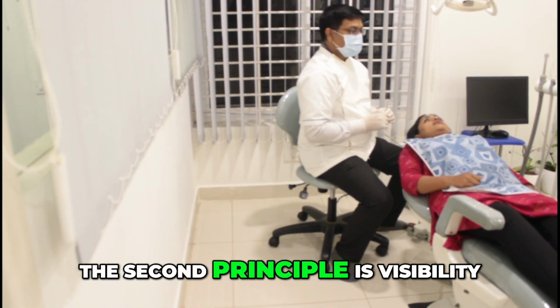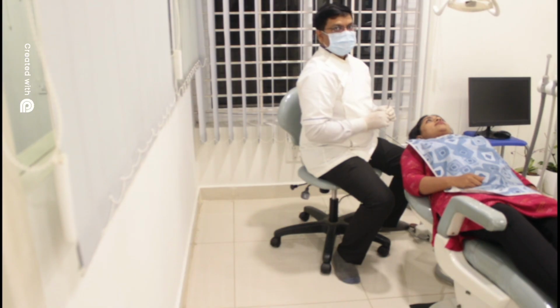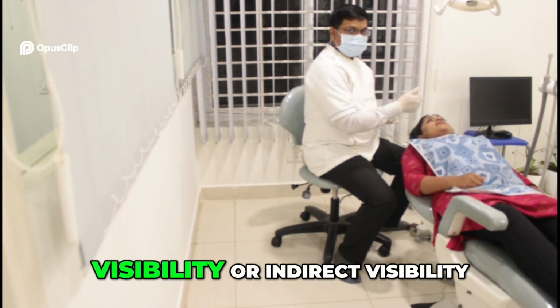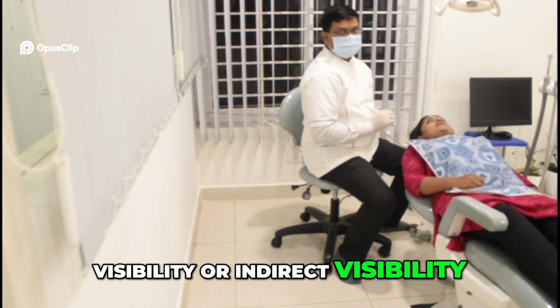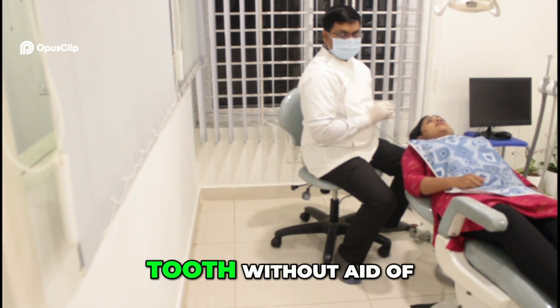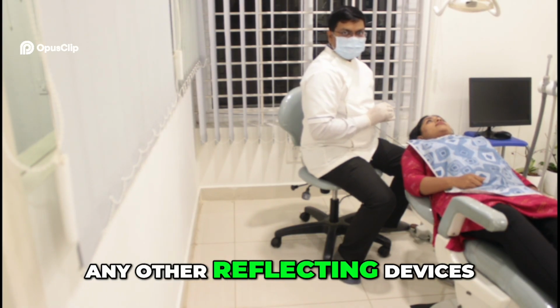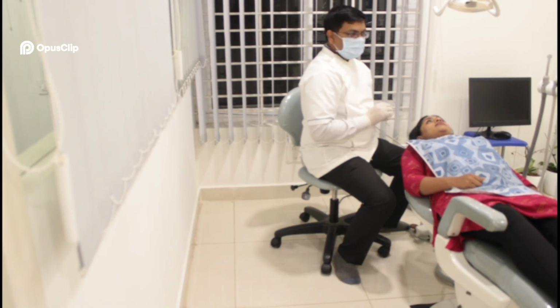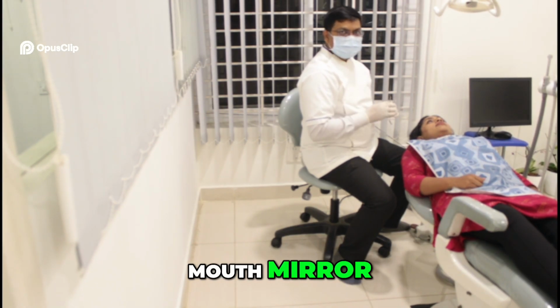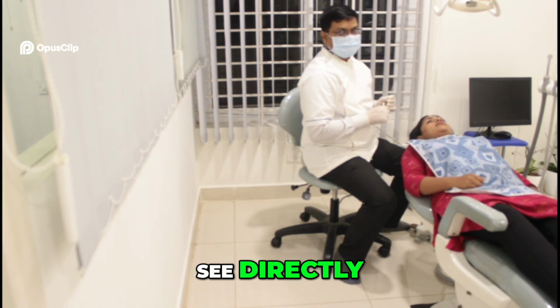The second principle is visibility, illumination and retraction. When we say visibility, it is either direct visibility or indirect visibility. Direct visibility is when I directly see the tooth without the aid of any mouth mirror or any other reflecting devices. Whereas indirect visibility is with the help of a mouth mirror, where I see the areas which I am not able to see directly.